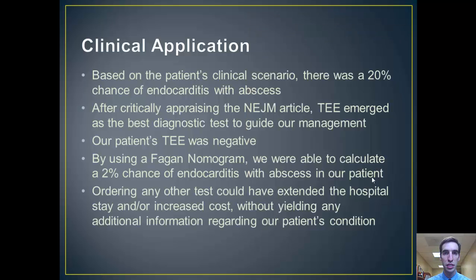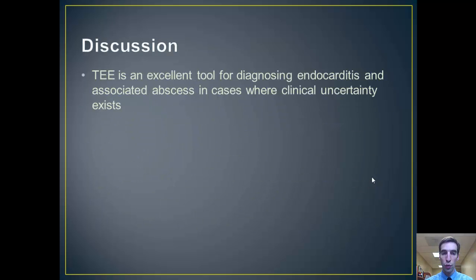We shared all of this clinical information with our patient, and we decided that no further testing would be needed. Ordering any other tests could have extended the hospital stay and/or increased costs without yielding any additional information regarding our patient's condition. With that, we decided that TEE is an excellent tool for diagnosing endocarditis and associated abscess in cases where clinical uncertainty exists. Thank you very much for watching this case.